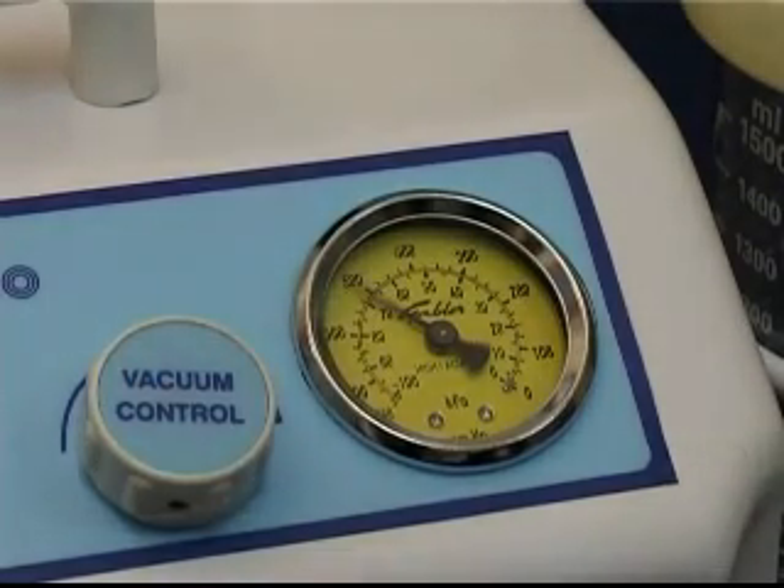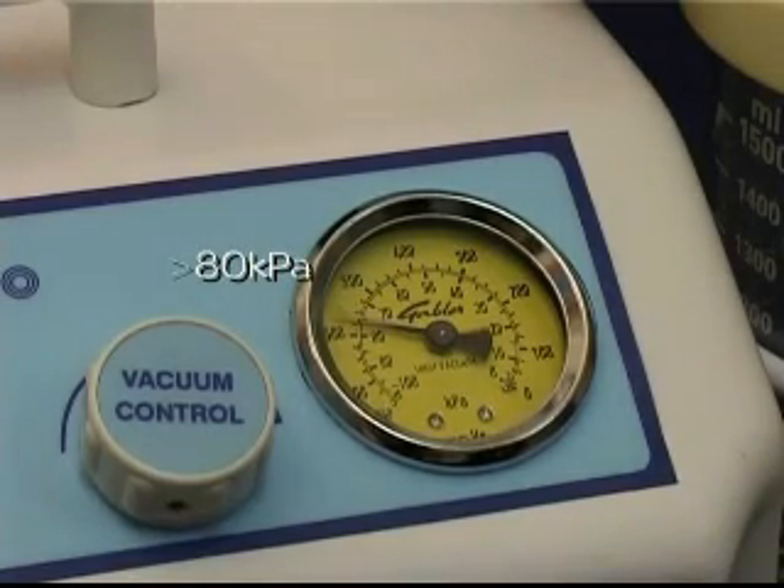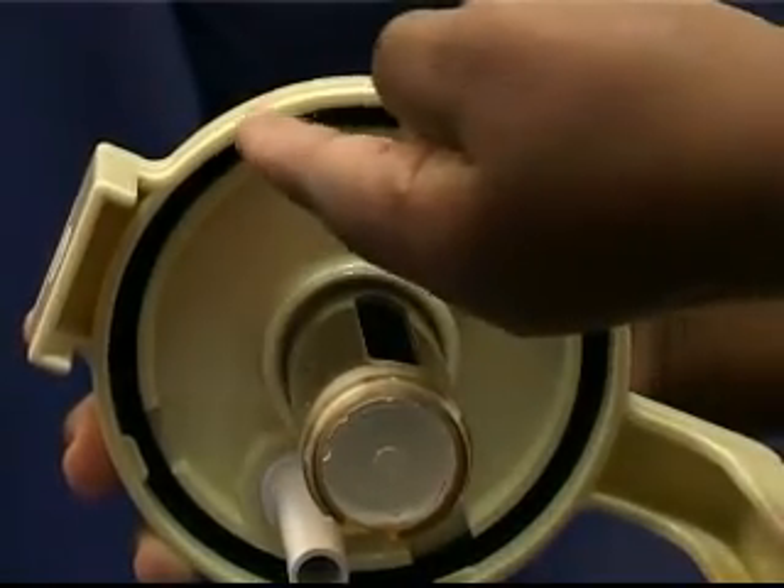After that, the gauge should continue to rise until the maximum vacuum is attained, which should not be less than 80 kPa. Ensure that the rubber gasket in the bottle cap is not broken or perished.